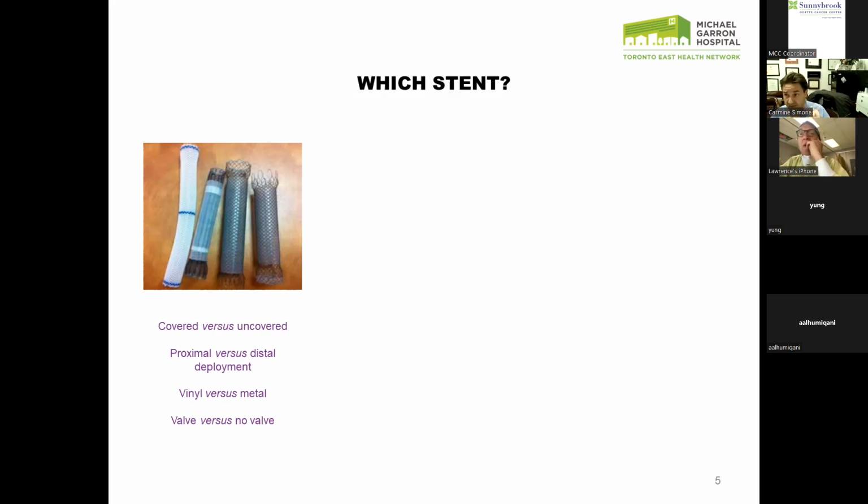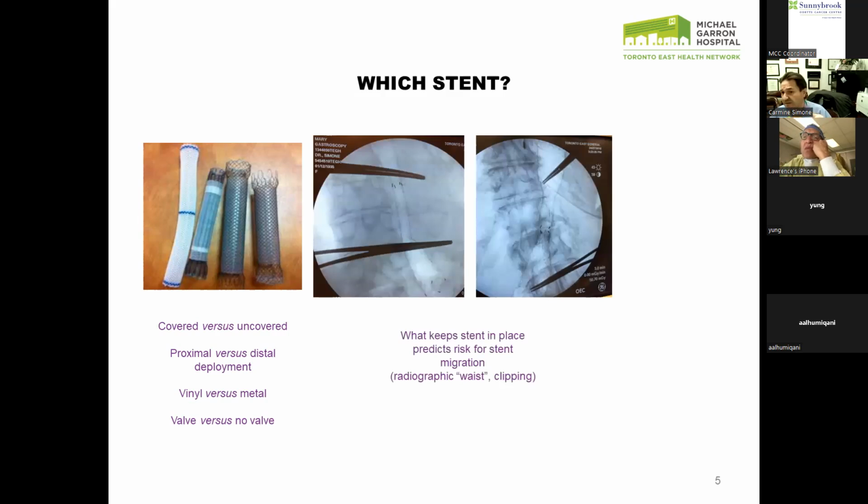We did actually carry them at one point. We stopped carrying them because there was a recall. There would be people that had a significant amount of buildup of food, and so the valve would get blocked. And so we were scoping and dilating people that had stents. We had a series of about 4 or 5 in a row, so we stopped. We have not re-explored that option, but just so that people know, we no longer carry them, and we may explore that in a year or two if they change the technology of the valve. So those are 2 perfect examples.